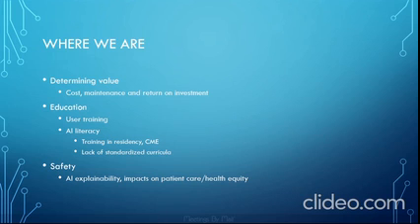There are also questions of what level of AI education is required for the tools that are being brought into clinical practice. Users should certainly be well versed on understanding what an application does and recognizing and troubleshooting errors when they occur. With a single application or a small number of simple applications, this could be reasonably done on a case-by-case basis. But when a larger number of more complex tools are integrated into workflow, it becomes more obvious that a general artificial intelligence literacy will soon need to be part of radiology training and likely medical education as a whole.